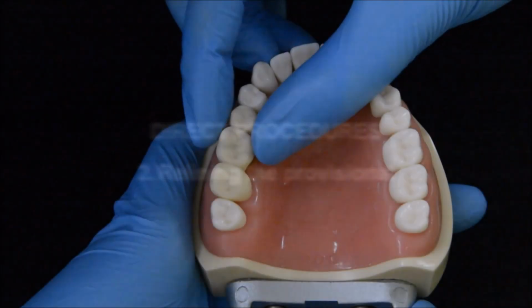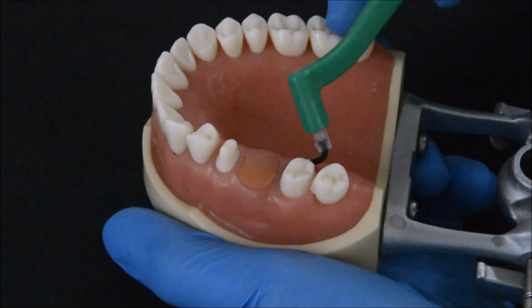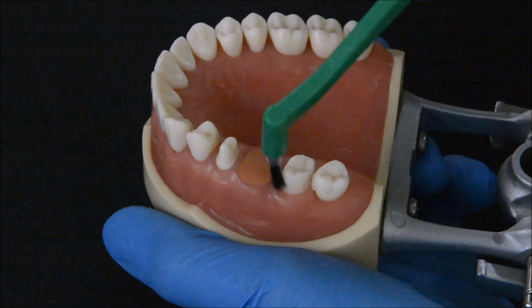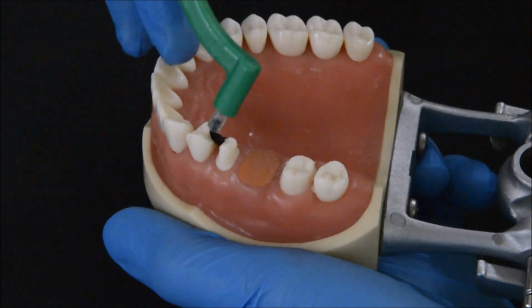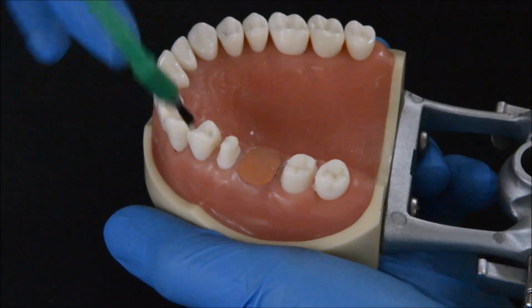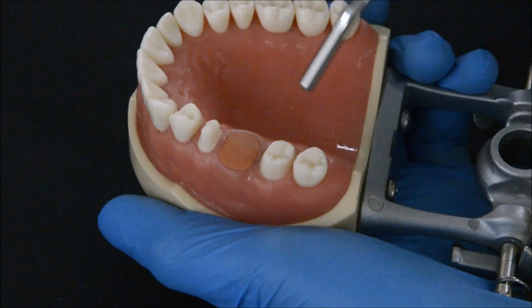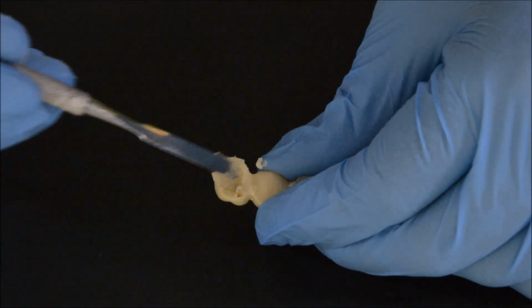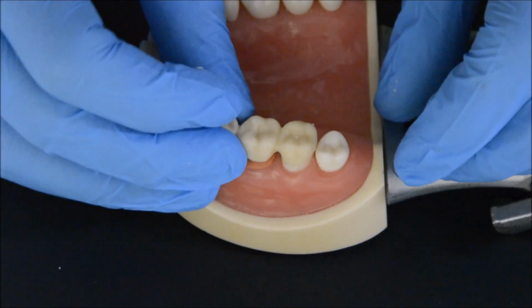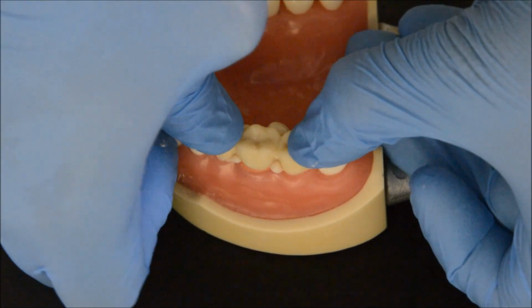As the provisional will still rock on the preparation, it will require relining. Vaseline is applied on the prepared abutments and also on the proximal surfaces of the adjacent teeth. Blow away any excess using an air syringe. PMMA is carefully loaded in the retainers and the provisional is placed on the prepared abutments and pressed down firmly till final seating position, followed by occluding the teeth.